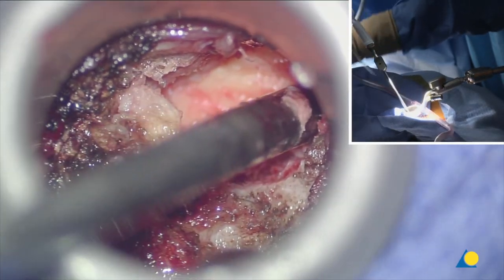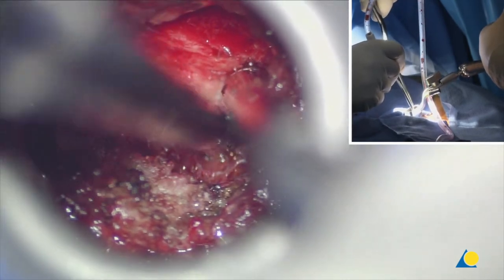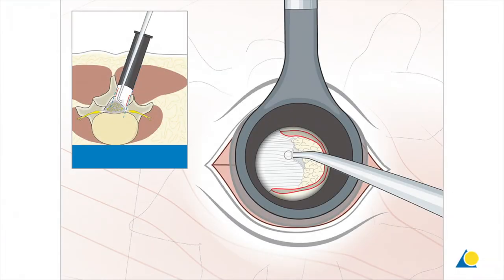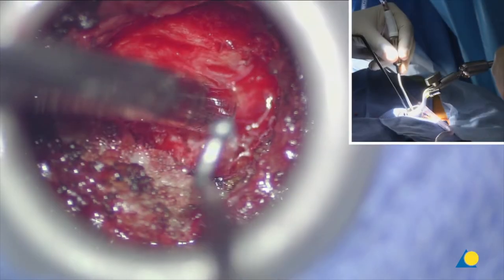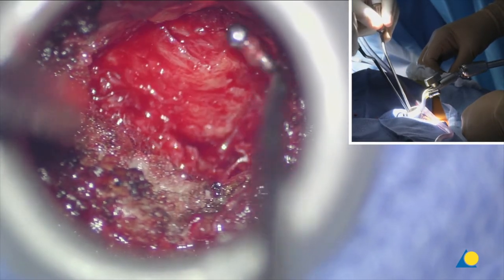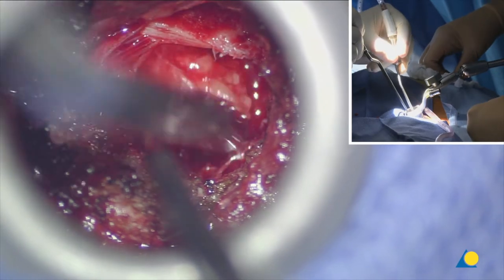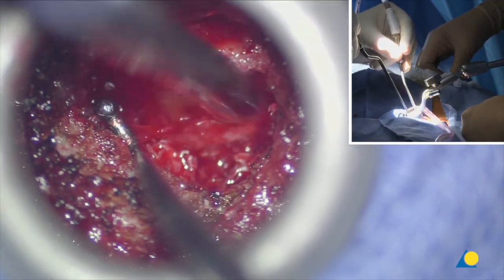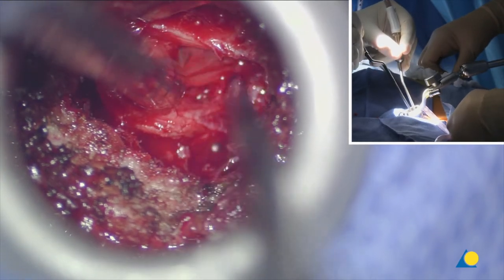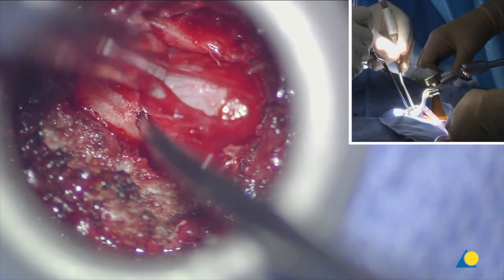The next step is to find the insertion of the yellow ligament cranially. I can see the epidural veins. I can go a little bit more medial and lateral with my bone removal to get a better exposure. Now I've got a nice entry point under the ligament. I put my ball tip probe underneath and lift up the ligament caudally, removing the epidural fat and the ligament. This is the dura underneath.